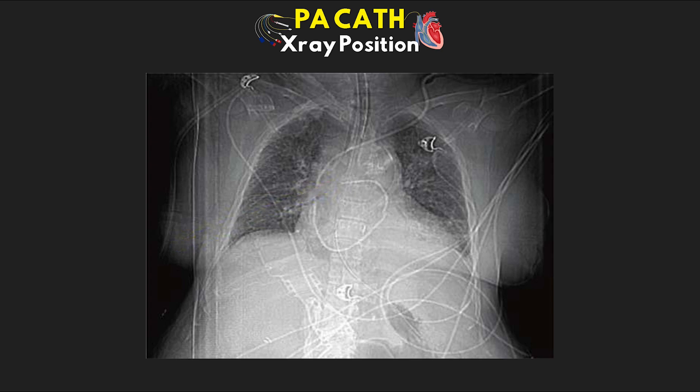Now here in example five, are you able to tell what's going on and what might be a little different? Hopefully you're able to see that this is actually just an example of a left IJ insertion. If we follow it along, it does properly terminate in the patient's right pulmonary artery.